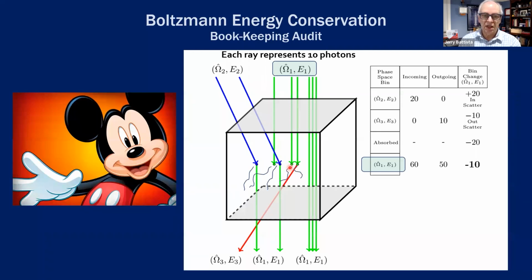Some of them just liberate an electron but don't scatter, for example, a photoelectron. In addition, we have two other energies coming into the voxel. They can scatter and produce green particles, which we are interested in. That's an example here and here. In this case, going back to the green ones, if they lose energy, they don't have energy E1 anymore, so we don't want to count them in our phase space.